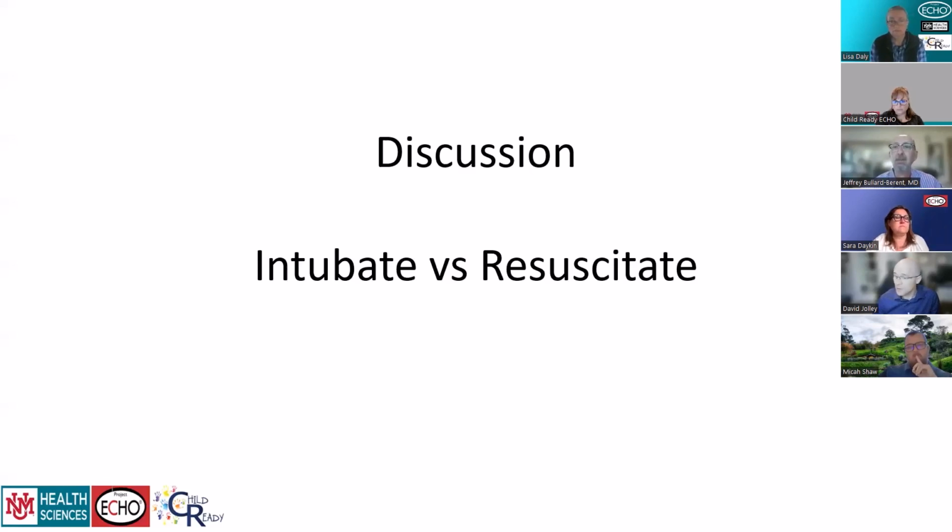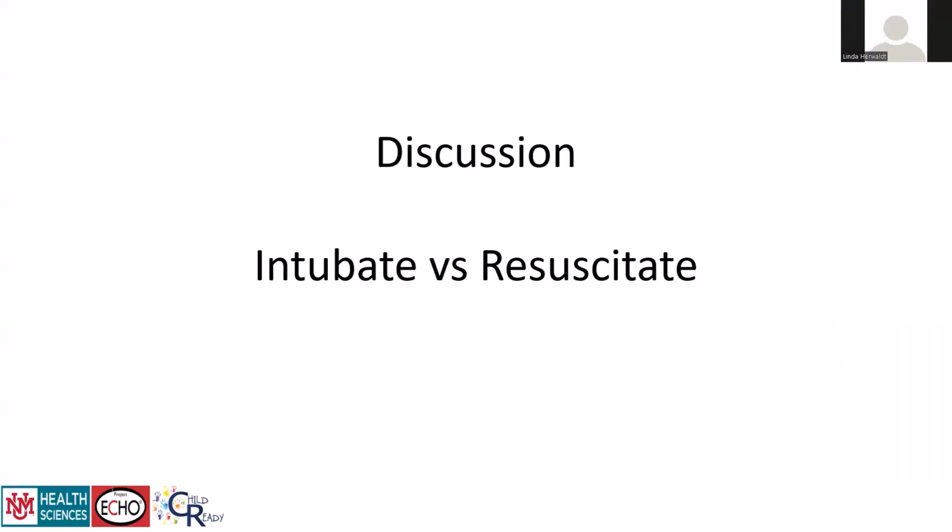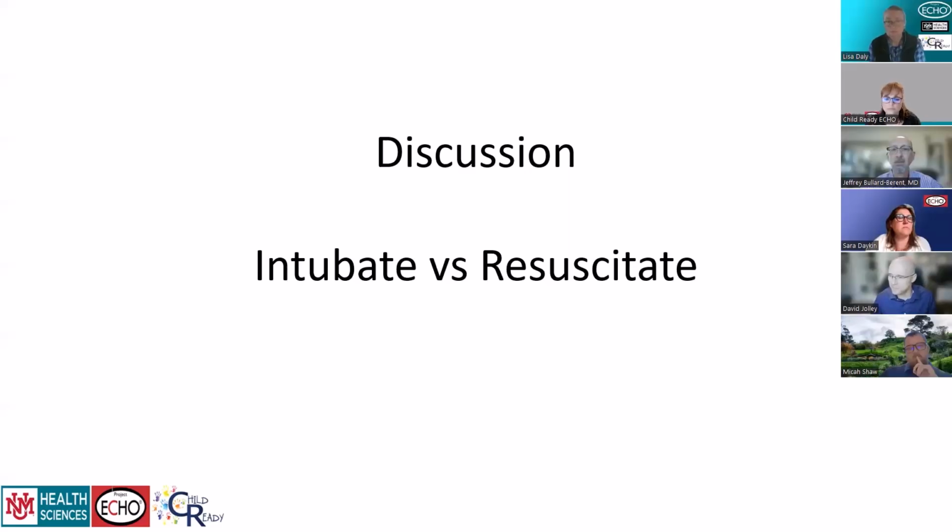I honestly don't know. So Micah put in the comments here, is it common for an ALS ambulance to have tiny LMAs? Is anyone here on with an Albuquerque ambulance or with an EMS crew? Do you tend to have some small LMAs? Because they can get really tiny. We have them. I don't think I had to use one for a newborn, but they can go all the way down.